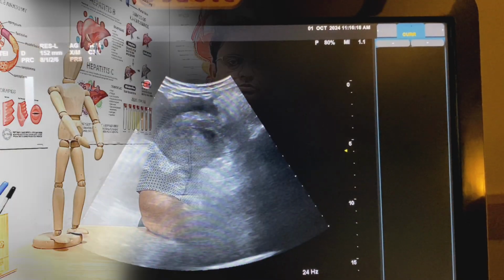Now how we will write the report. Uterus is absent as the patient has a history of hysterectomy. Right ovary is enlarged in size, measuring 61 milliliters, and shows heterogeneous solid cystic texture. On color Doppler, minimal or no flow is present.